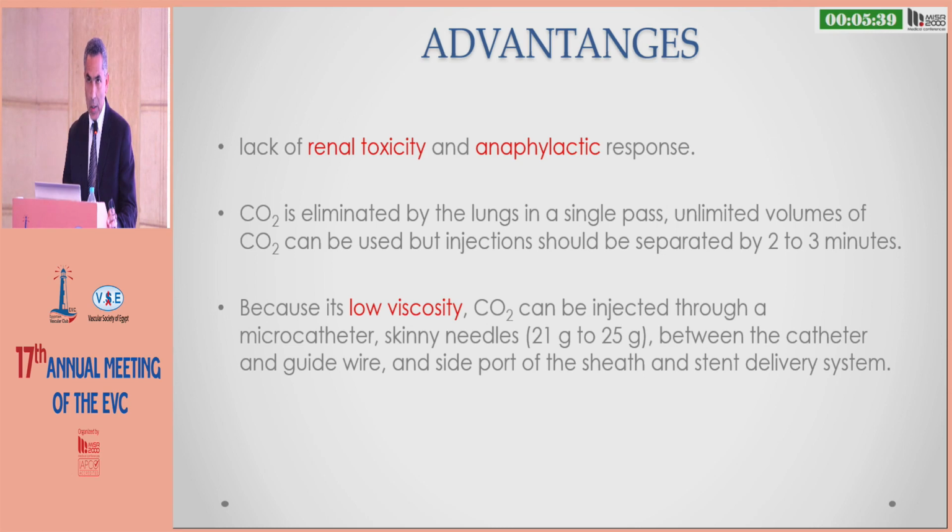And you can see the advantages of CO2: of course, the lack of renal toxicity and anaphylaxis. And its low viscosity allows its injection through microcatheters, and even through a side port with a catheter and a wire inside, and from the side port of the delivery system in case of EVARs.